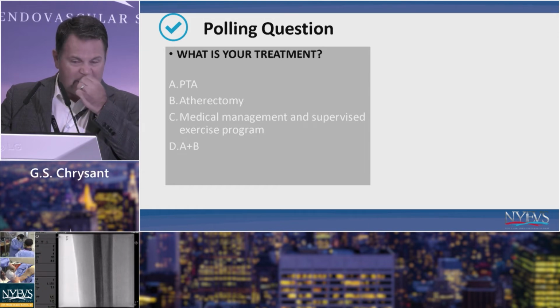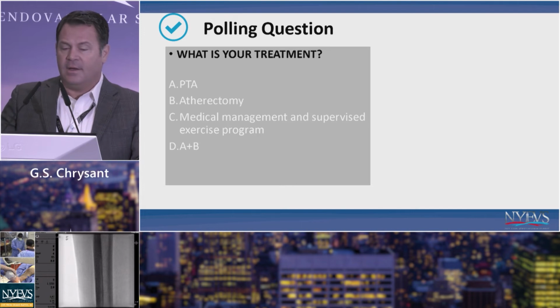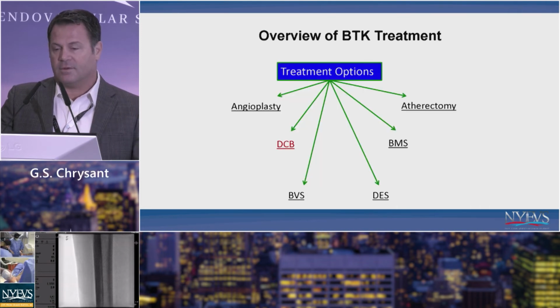So in terms of this person, in treatment, you have probably PTA and atherectomy. I think, once you've had a wound, you're probably a little bit beyond the supervised exercise program, but all of this is important for peripheral disease. So again, the different options.